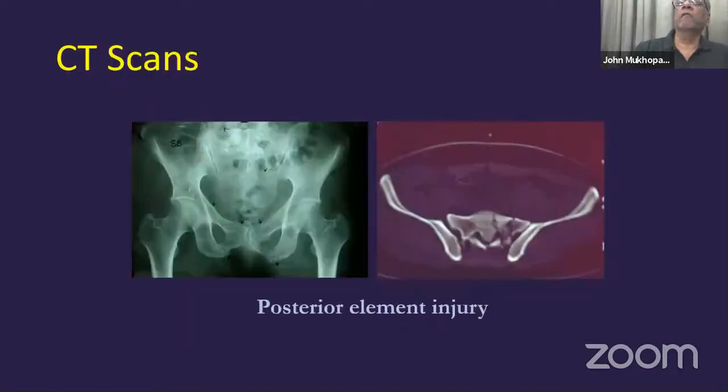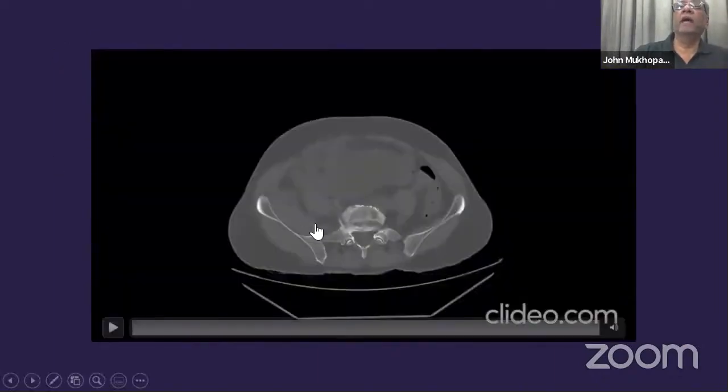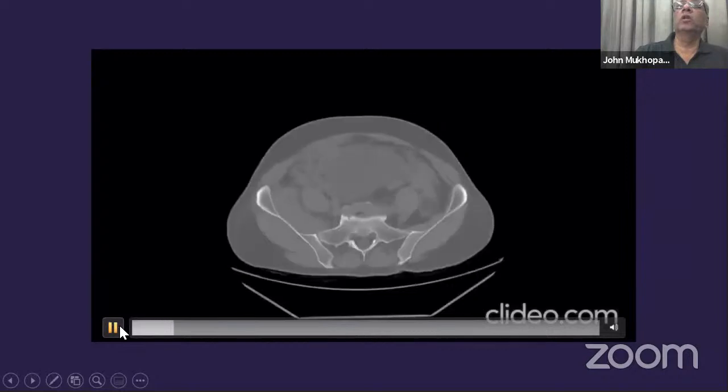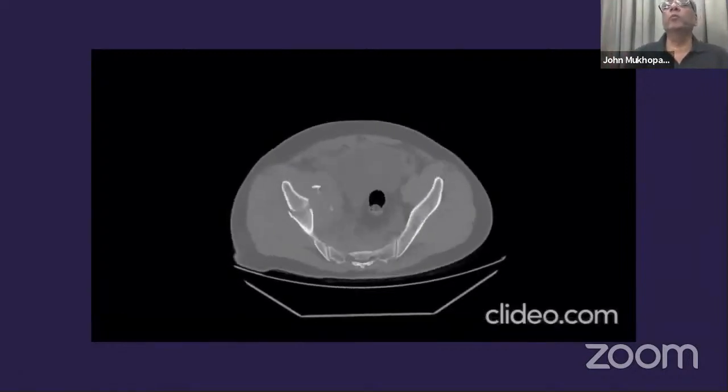Okay. Once you've done all these, you can also, if you have, as I mentioned last time, the console with you, it's a nice thing to run through it from top to bottom.